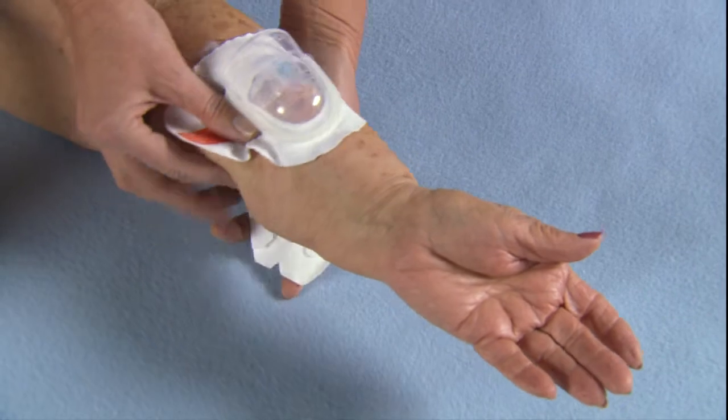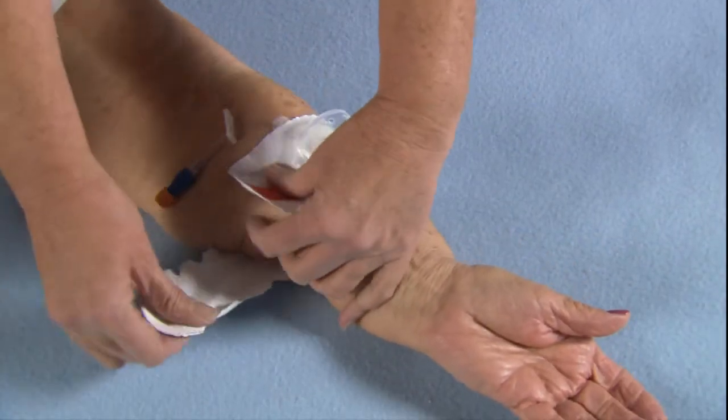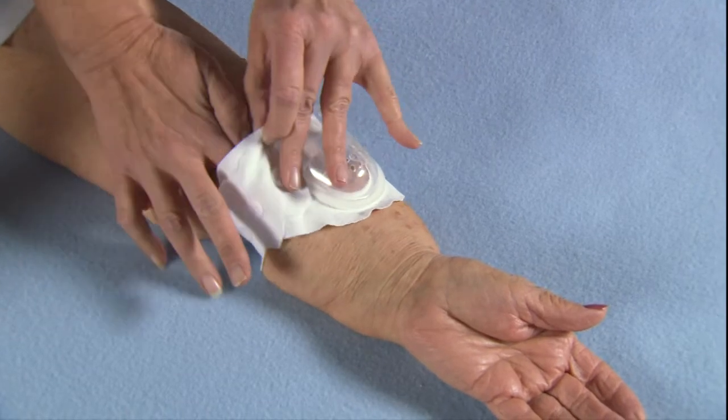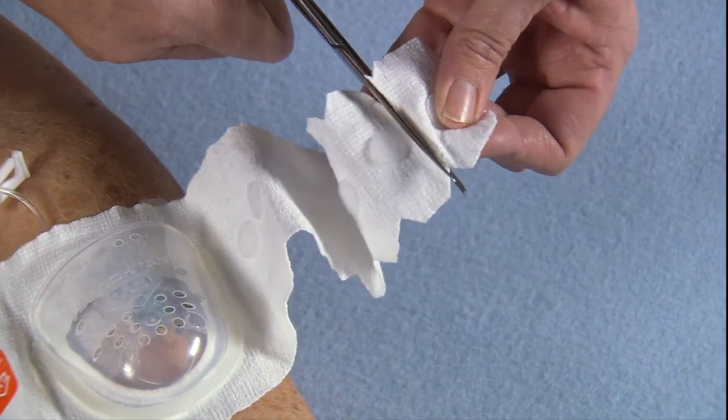Protect the loop of tubing and catheter hub with the plastic dome. Wrap comfortably, leaving enough stretch to fit a finger under the fabric. Cut off excess fabric.